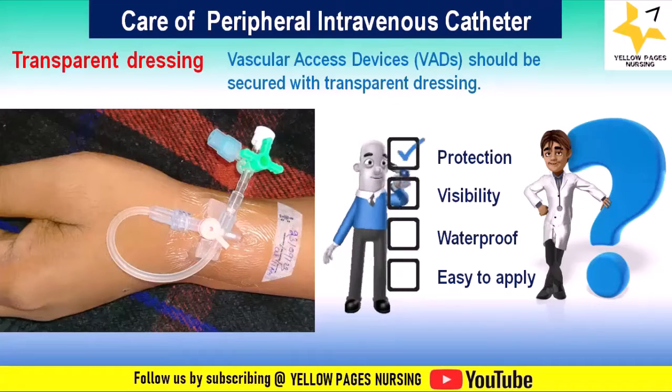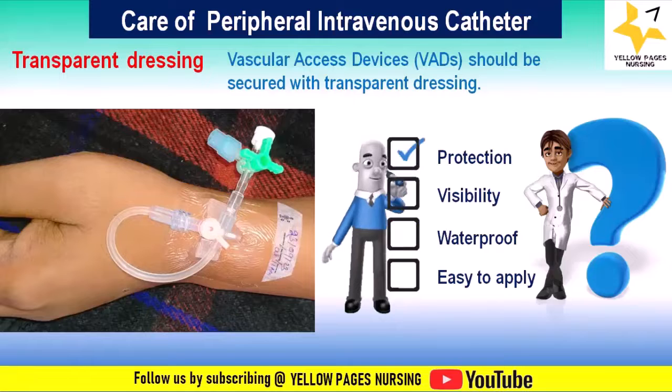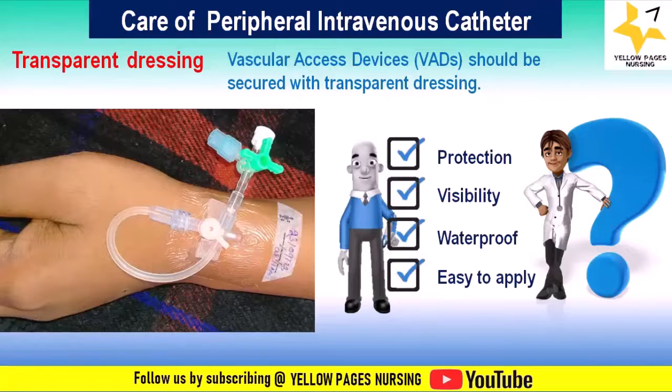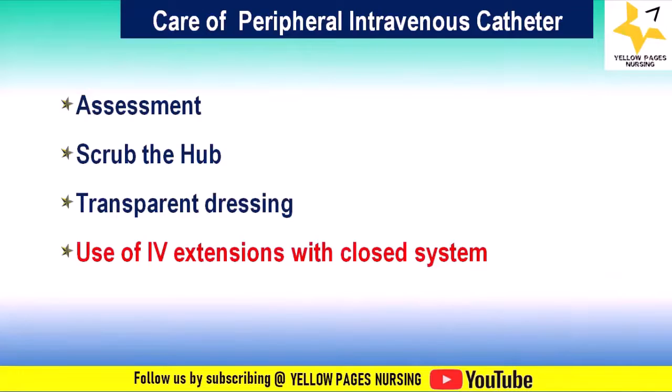Next is visibility. Transparent dressing allows healthcare providers to monitor the site for signs of infection, redness, oozing, inflammation, or other IV complications. Moreover, these dressings are waterproof and easy to apply when compared to any other devices. Next comes use of extensions with closed system.